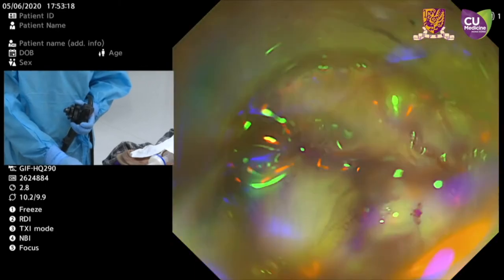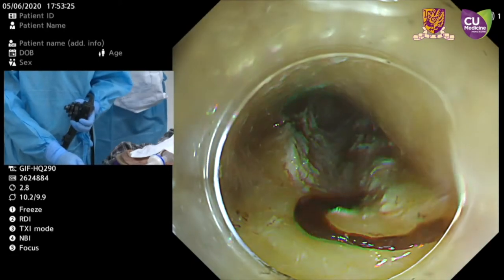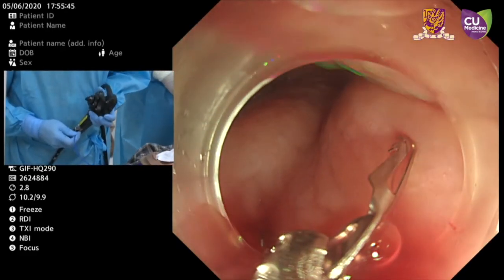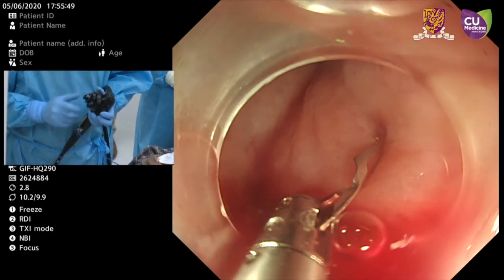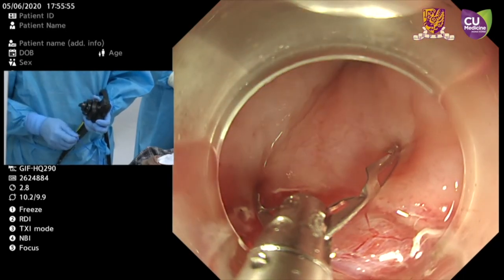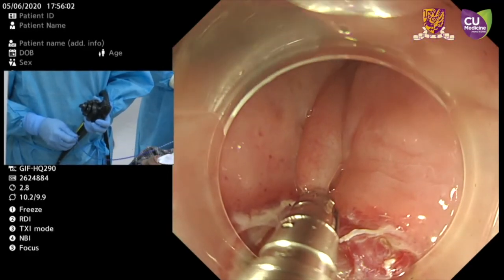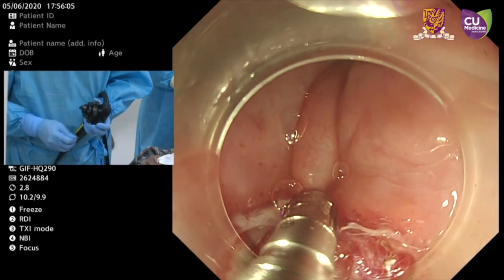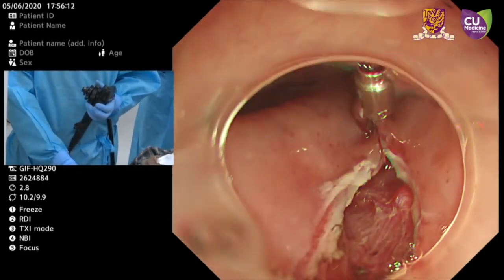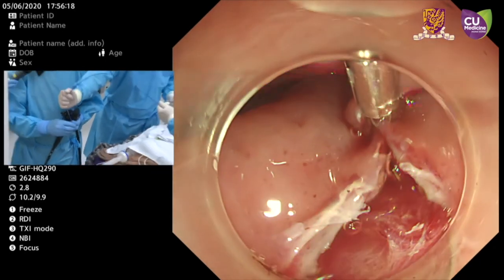Now we have completed the myotomy and we use the RDI mode to observe. There is no bleeding from the muscle edge. This is the proximal side, and this is the mucosal entrance of the tunnel. The first clip should be placed at the angle of the incision. The first clip is probably the most important — clear the field, suction a little bit, and then close the clip. Observe, and if we are satisfied, fire the clip. If we are not happy, we can open and reposition the clip.